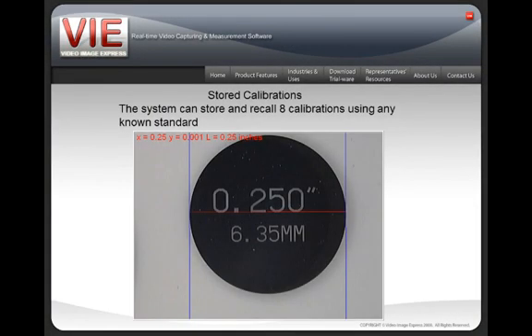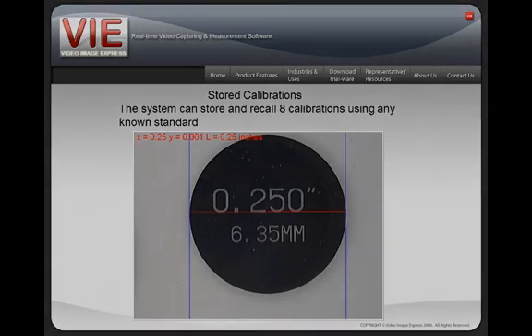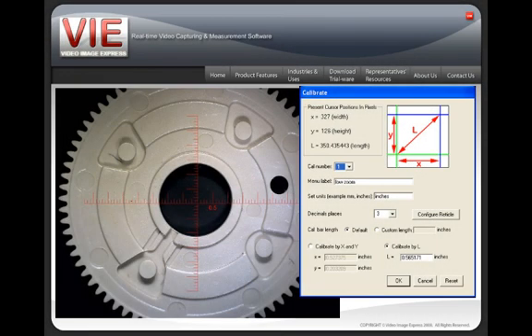Video Image Express has the ability to store and recall different magnification settings. You may calibrate any position to a known standard and store that calibration. Since measurements are based on pixel size, this is a unique and powerful feature. We also have a customizable video reticule which can be displayed in inches and millimeters.